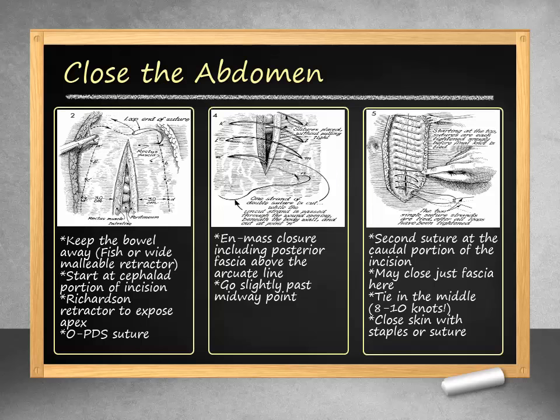Finally, you will close the abdomen. The bowel is retracted posteriorly with a fish retractor or a wide malleable retractor. PDS suture is then used to close the incision beginning at the cephalad portion, done with an en masse closure. A second suture is started at the caudal portion and the sutures are tied in the middle of the incision. Staples will be used for skin closure.